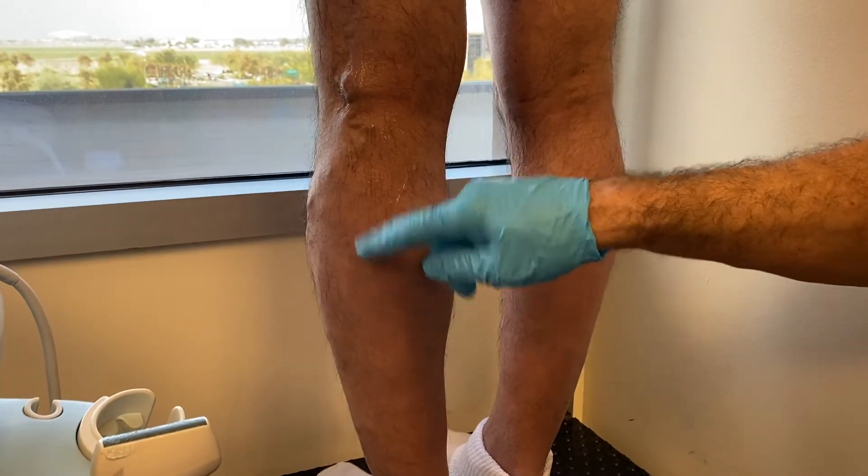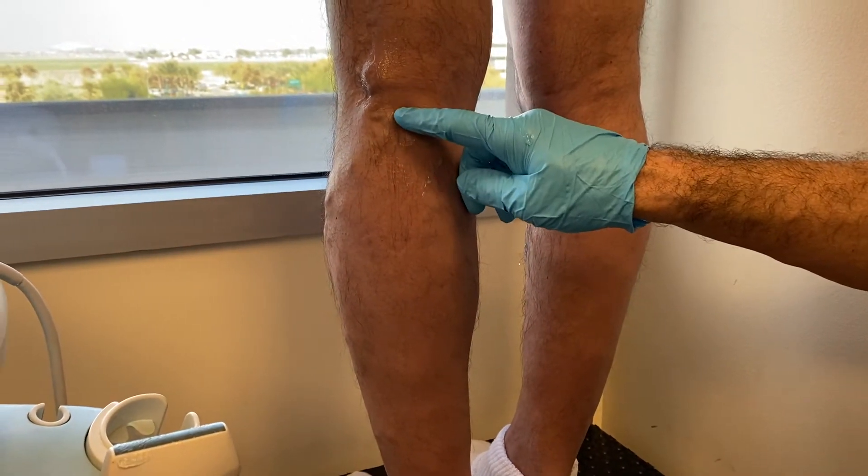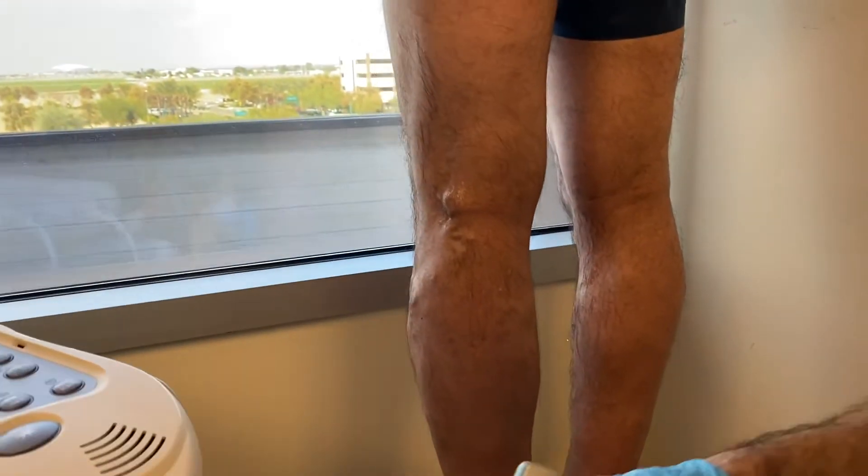If you weren't looking carefully, you'd think it's a short saphenous vein, perhaps. This is something that's often overlooked in this area, or maybe misnamed — it's called a popliteal fossa perforator.